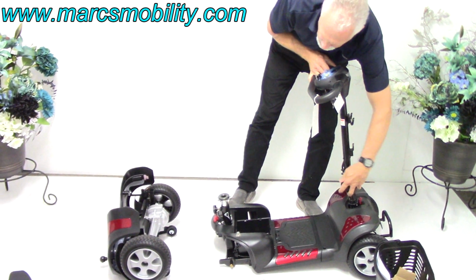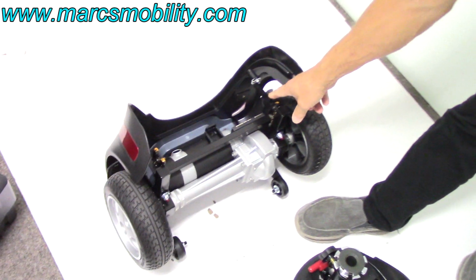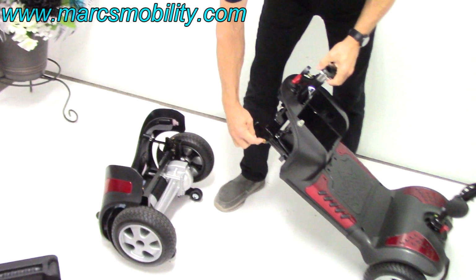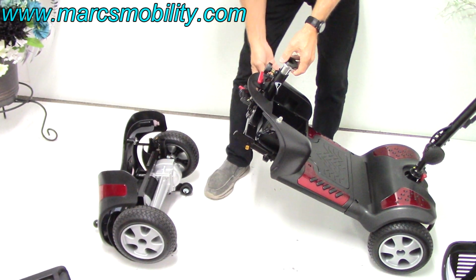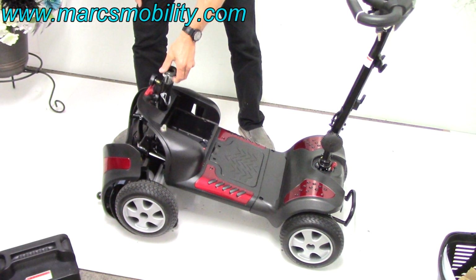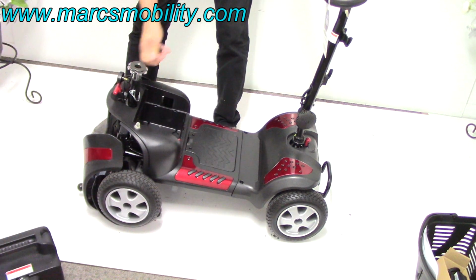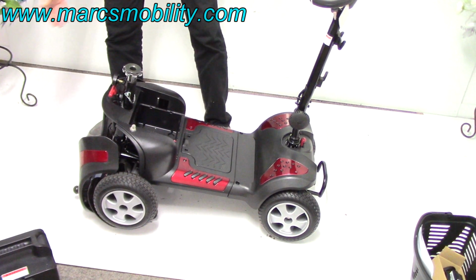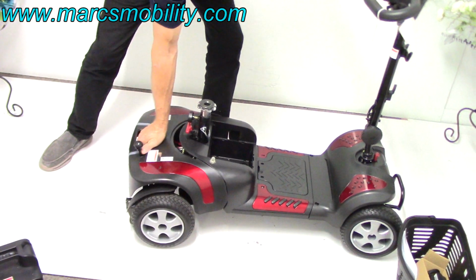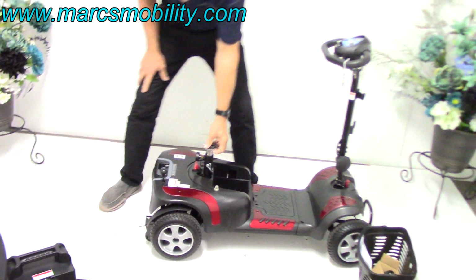And if you look at your scooter right here, there are little brown marks on the scooter. It's the same thing on these marks right here. There's brown right there. You want to bring this latch, you want to bring those as straight as you can, right into those slots. If it's not straight, just straighten it out until it's in there. When it's in there like that, grab the back of your scooter, bring it up slowly, and we didn't do it right.